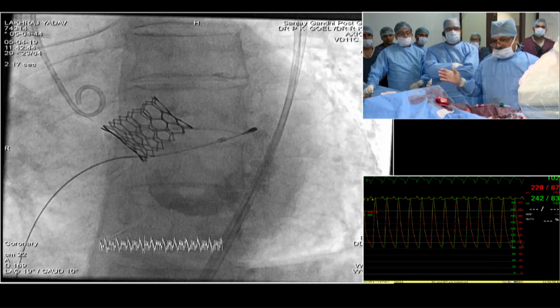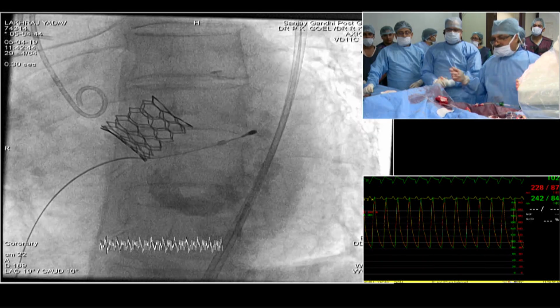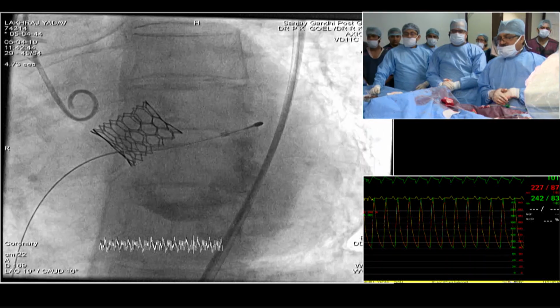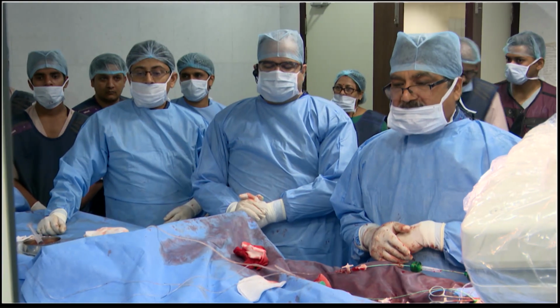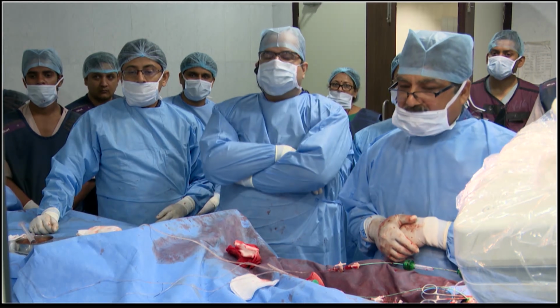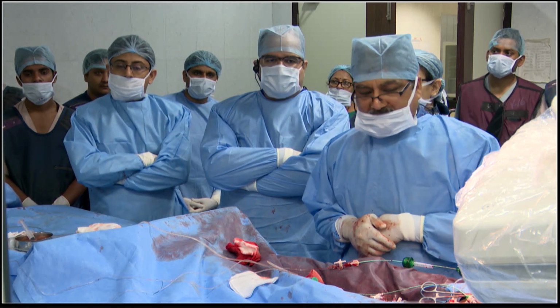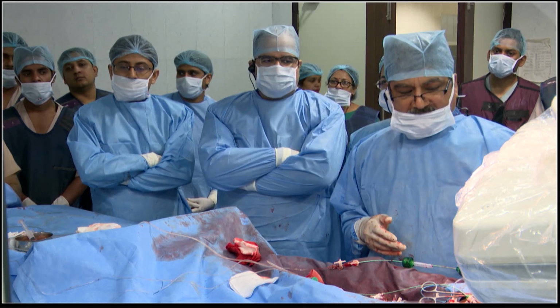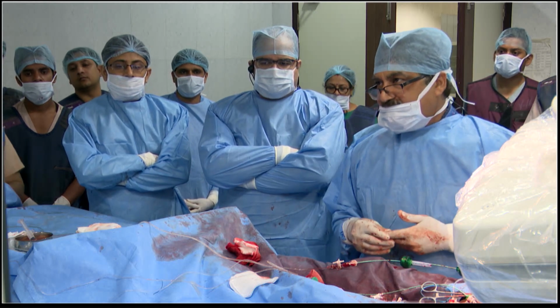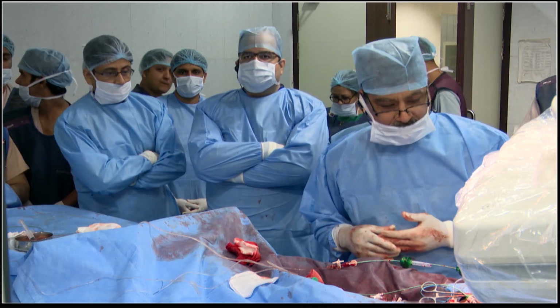Yeah. The patient is very important, but anyhow, with all the team that we had, we could bail him out, and I think this was a very strong and a very good bailing out. If one realizes that, almost having an arrest and then you getting him back. Congratulations for an excellent demonstration, bailing out the procedure, sir. Yeah. I'll just close the ProGlide from here, and this was a Python sheet, 14 French, through which we have put the valve. Okay, fine. Thank you.